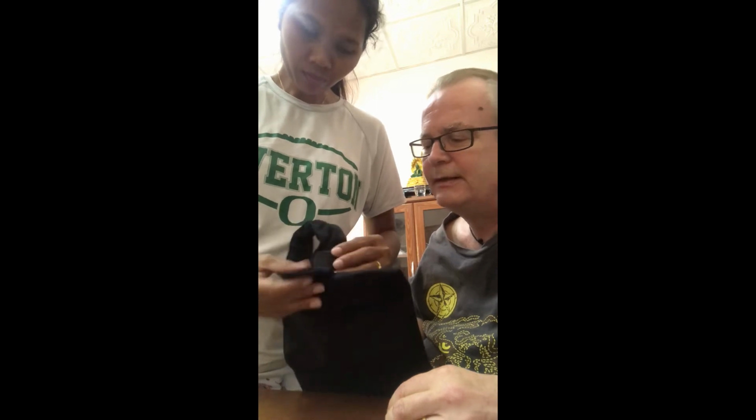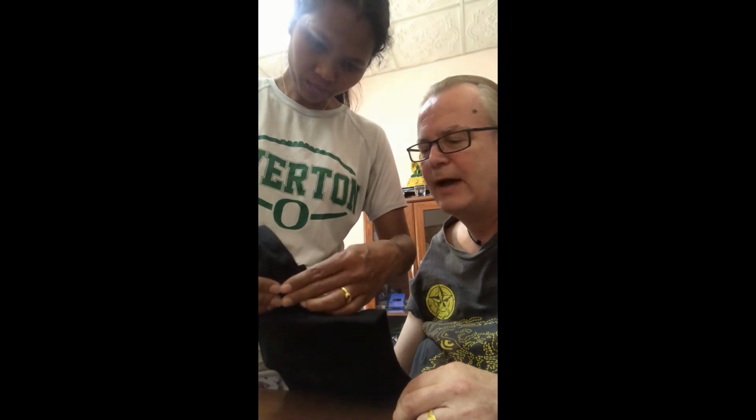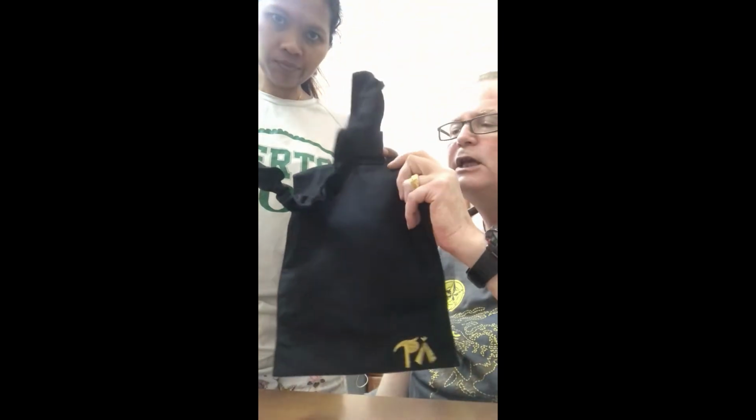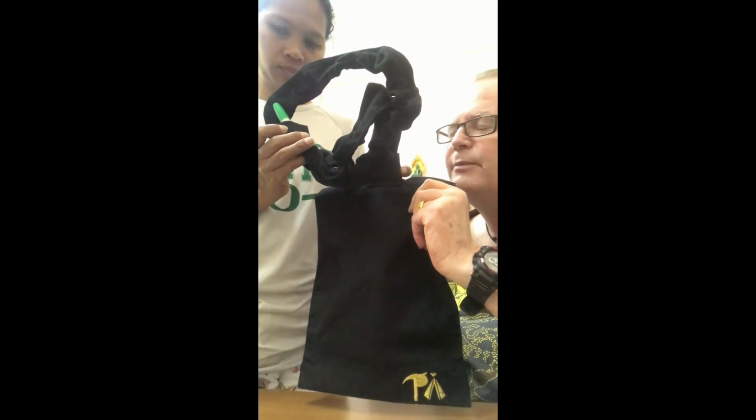So May's now just attached the pipe back to the main part of the bag, and there you have it. We'll turn it around so you can at least see the logo, if you want to put something pretty on the front. There you have a very useful, easy to use catheter bag. So just remember, it's 11 by 8 inches. It's heavy-ish material, strong material. You can wash it, and you can detach the bag from the pipe, and you can just have a great day.